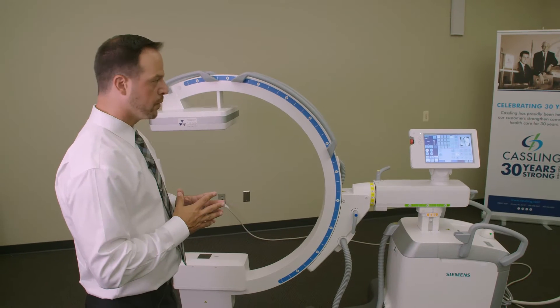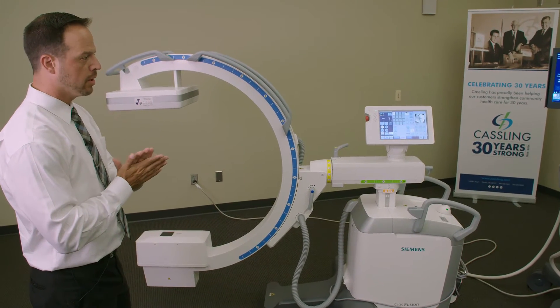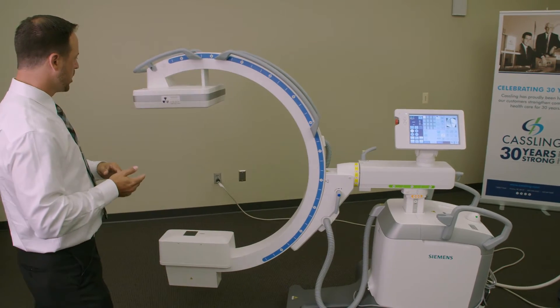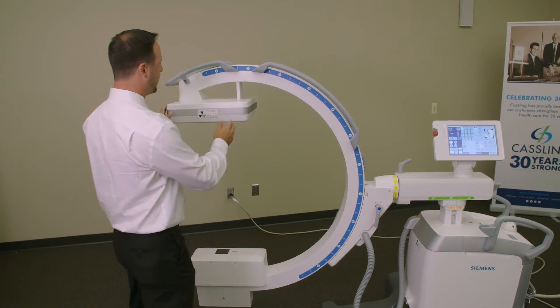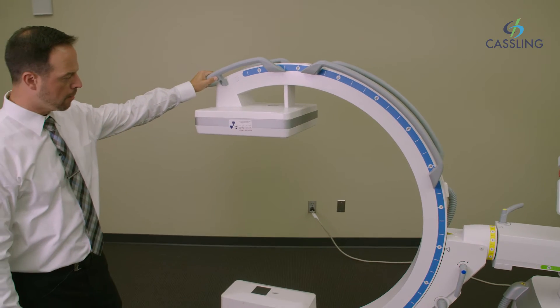This is our brand new COS Fusion Flat Panel C-Arm. It was just released at the beginning of this year, 2016. As we come over here, as you can see, we have our new flat detector on our C-Arm.